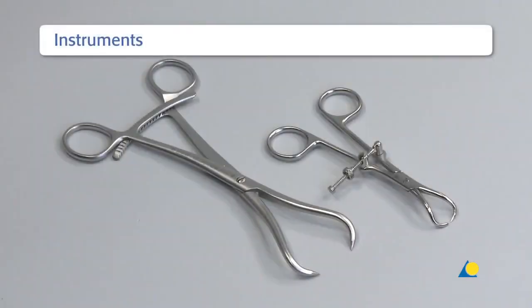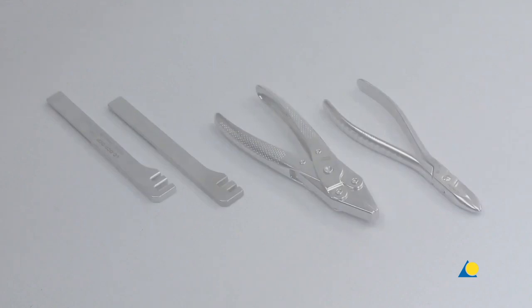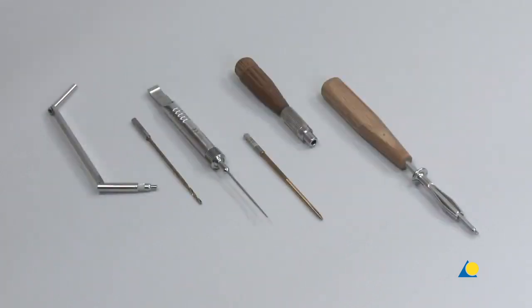The instruments for reduction are the large pointed reduction forceps and the small pointed reduction forceps. To contour the plate, 2 bending irons are needed. The flat-nosed parallel pliers and the wire-bending pliers can also be used. Also required: the 3.5 universal drill guide, the 2.5 mm drill bit, the depth gauge, the 3.5 mm tap with handle, and the small hexagonal screwdriver with holding sleeve.